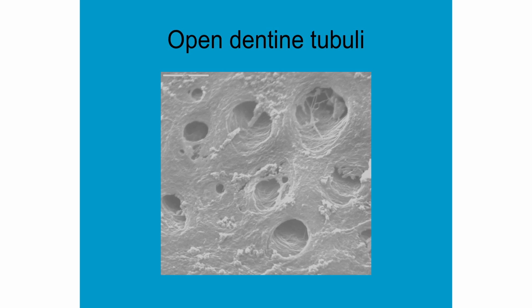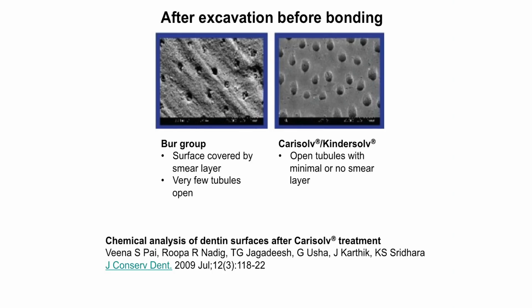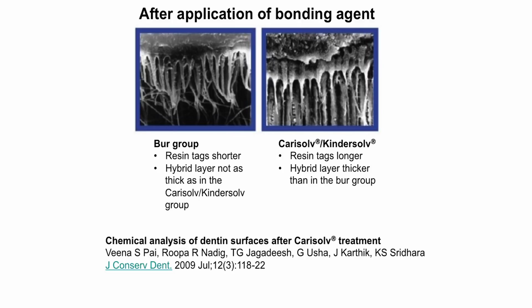It leaves open dentine tubules when you use Kindersolv. You will see a burr group which has a surface covered by smear layer, with very few tubules open. And in the Kindersolv group, there are open tubules with minimal or no smear layer. And after application of bonding agent, you will see in the burr group that resin tags are shorter and the hybrid layer not as thick as in the Kindersolv group.